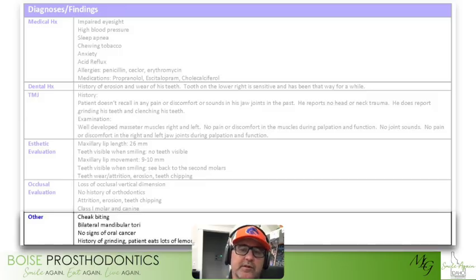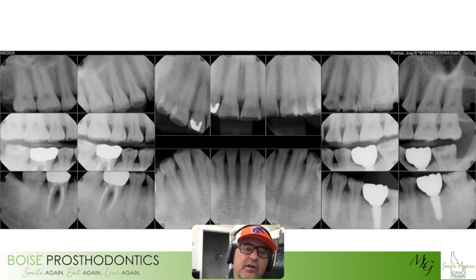his treatment planning process. I'll then look at all the teeth individually, with the photographs and x-rays or radiographs, just to identify if there's anything else going on that might be of concern for us.